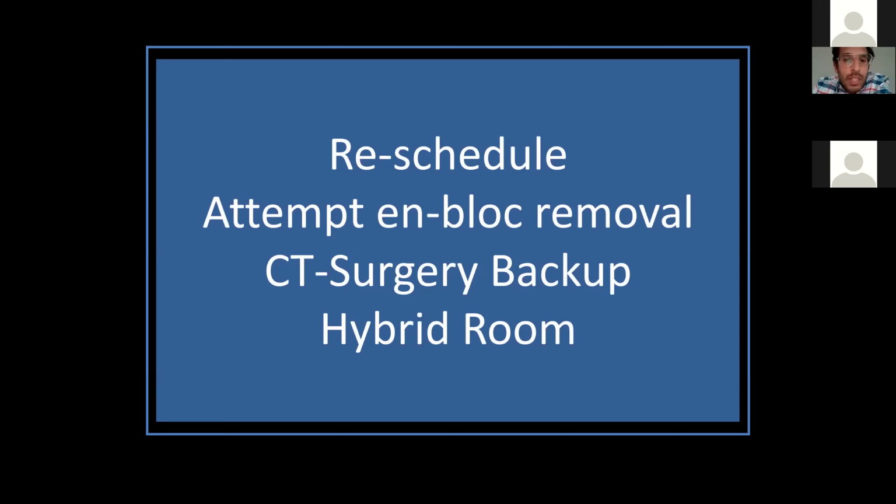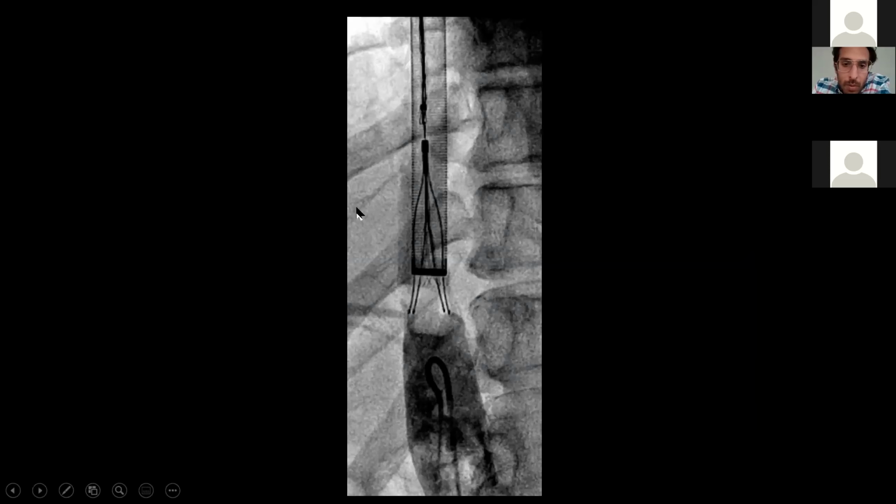And then what combos for DVT have you seen most effective? I think this case is a good example of where we'll see what combinations work. And again, to spare everybody the time and dramatics here, I told the patient, a young guy, there's two things that are going to happen. You're either going to take the clot out and it's going to be fine, or you're going to wake up with a giant sternotomy. But again, the clot will be gone.